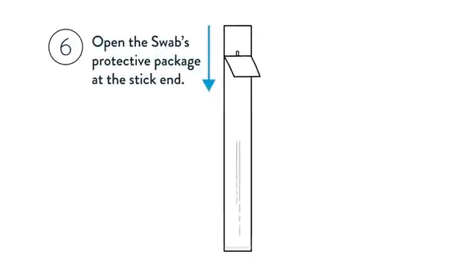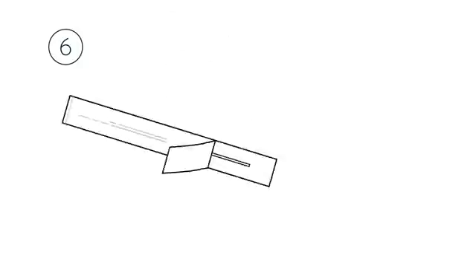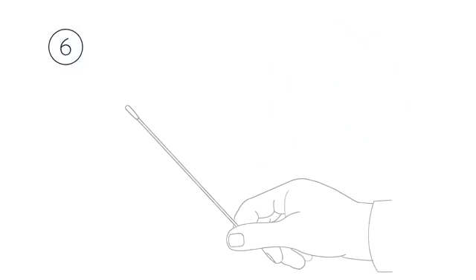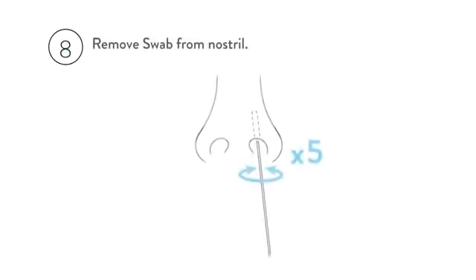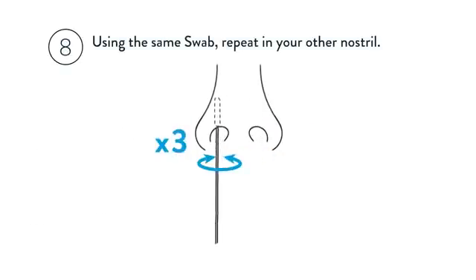Open the swab's protective package at the stick end and take the swab out, keeping your fingers away from the swab end. Swab both nostrils: insert the soft end of the swab straight back into your nostril until resistance is felt, about 2cm. Slowly rotate the swab, gently rubbing it along the insides of your nasal passage at least 5 times. Remove the swab from your nostril, then using the same swab, repeat in your other nostril.